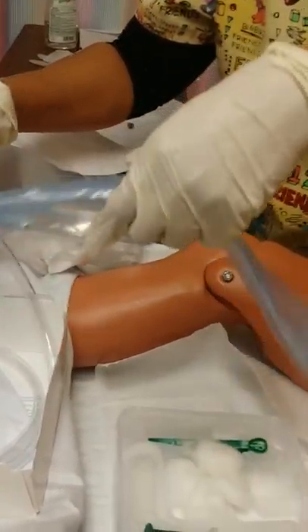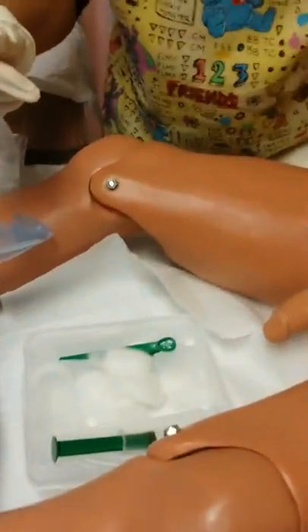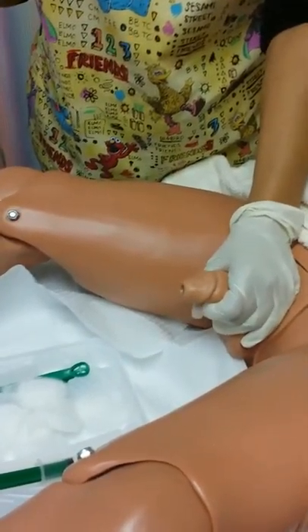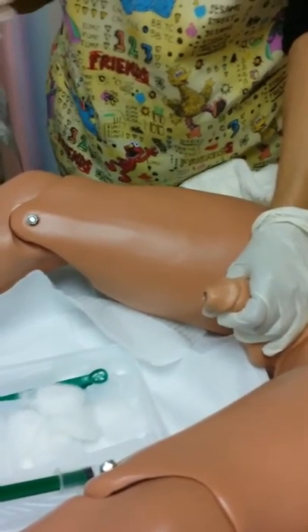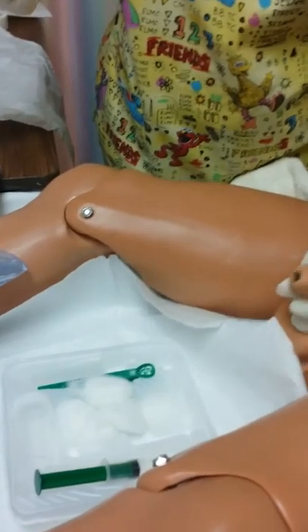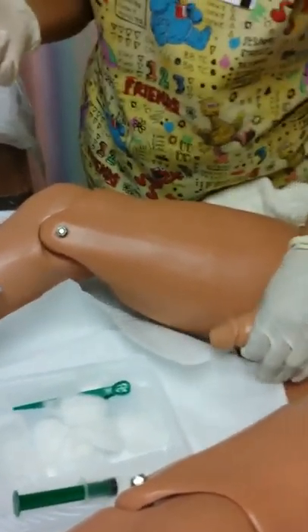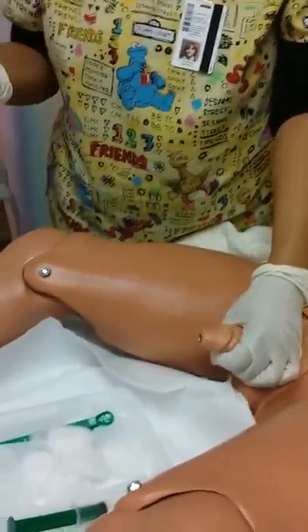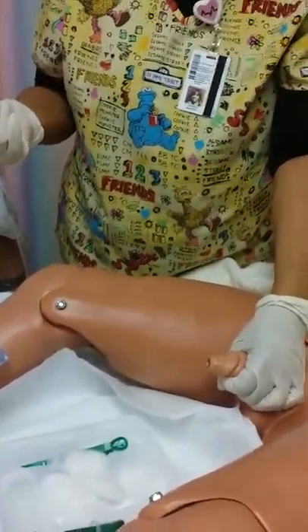Okay. So we have that secure, and I'll go ahead and drop that back in there. Okay. So I'll go ahead and grab hold of the penis with my non-dominant hand, ensuring to hold it at a 90 degree angle. But as you can see, this can't come up 90 degrees without pulling it off, okay? So we're going to simulate that it is at a 90 degree angle.